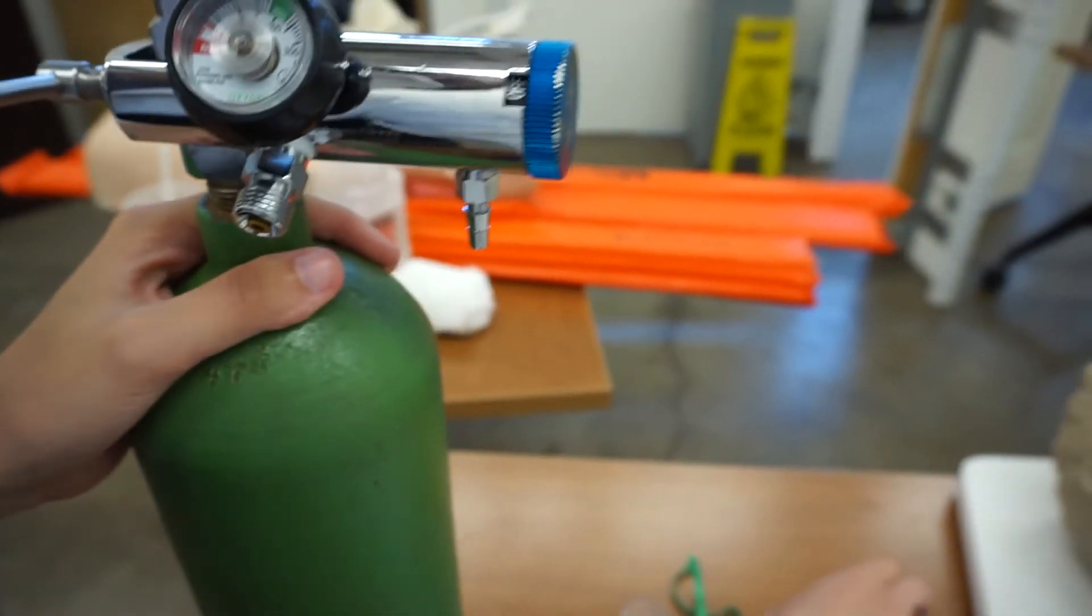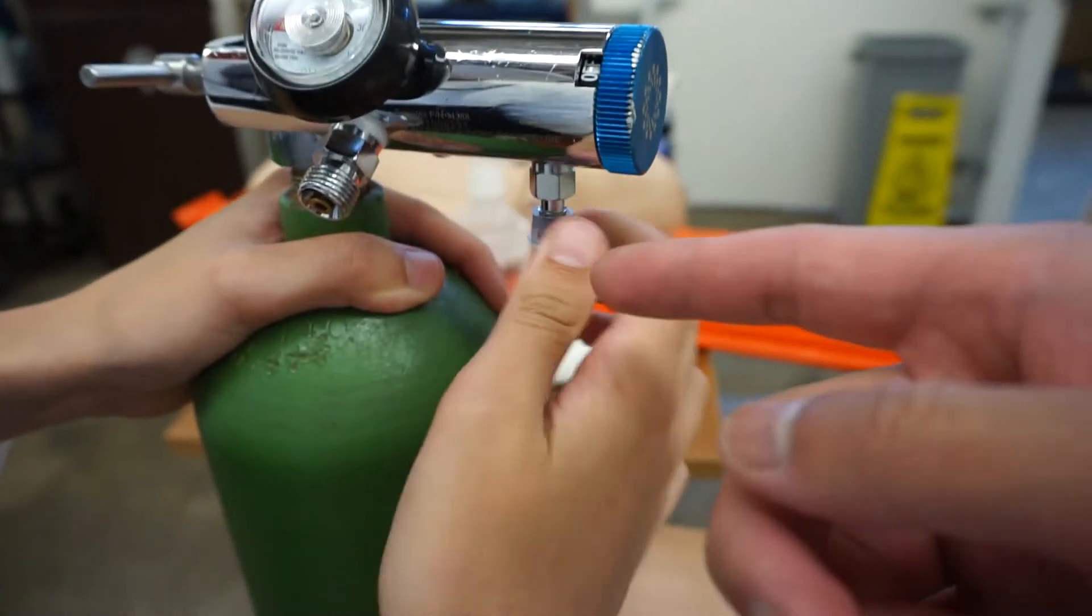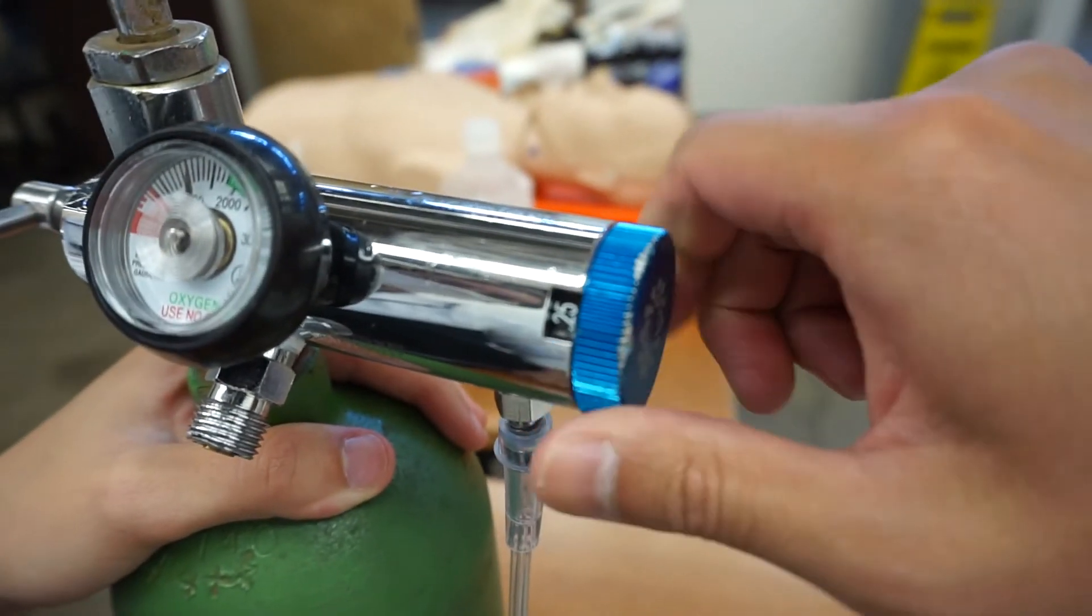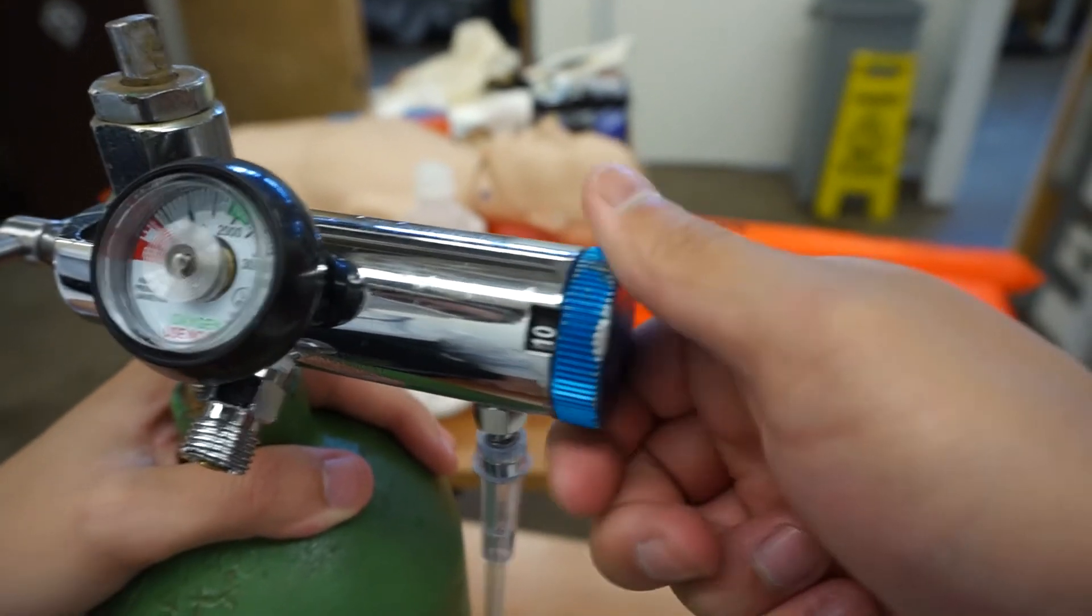And if we wanted to apply any piece of oxygen equipment, apply the tubing to this notch right here, and then you can adjust the flow rate all the way up to your designated rate.